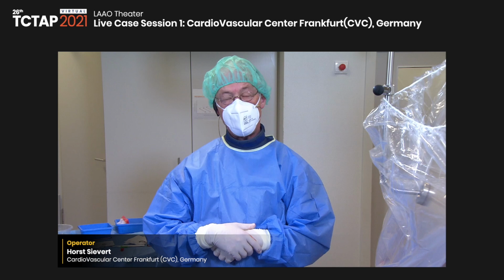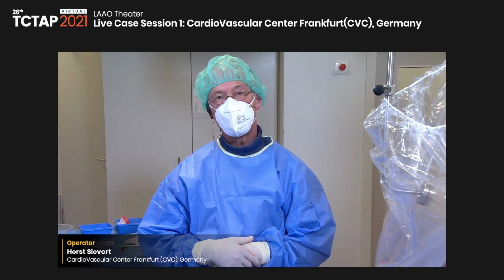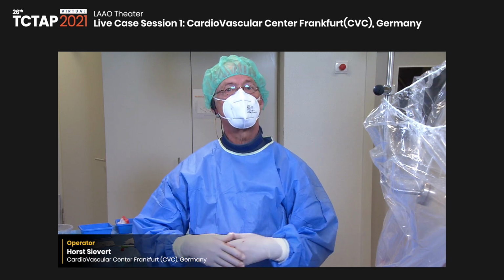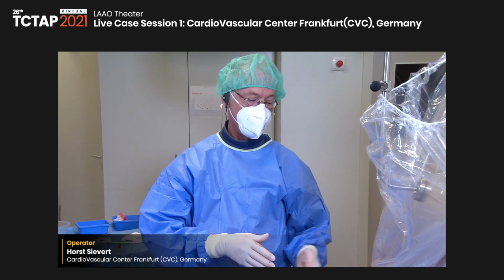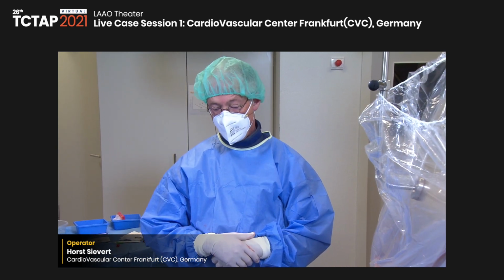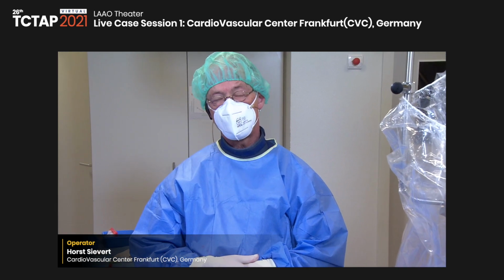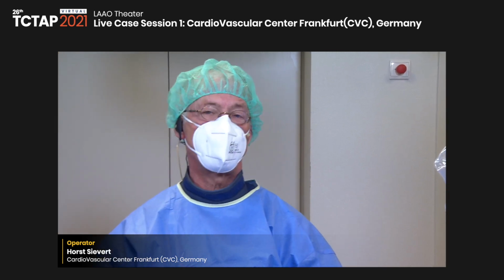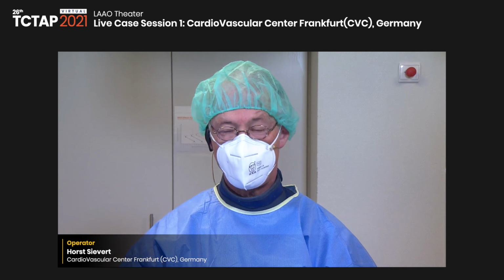Really the only way to increase the pressure in the left atrium would be to increase blood pressure. So to give catecholamines in order to raise the blood pressure, and then also the LVEDP, and then the LA pressure would increase. But this is kind of over sophisticated. So I think it's reasonable to just add 2 millimeters to all your measurements when the LA pressure is too low at the start of the procedure.